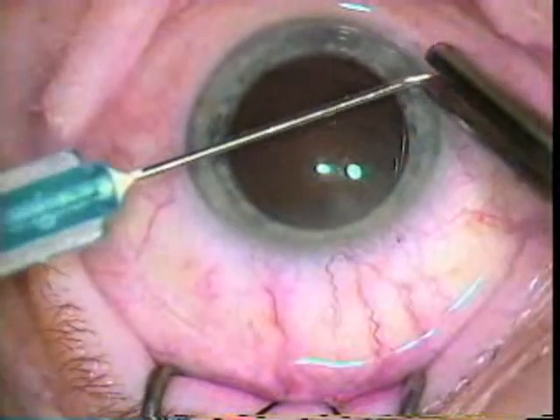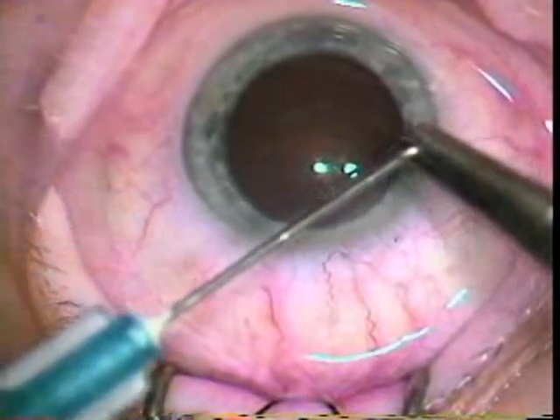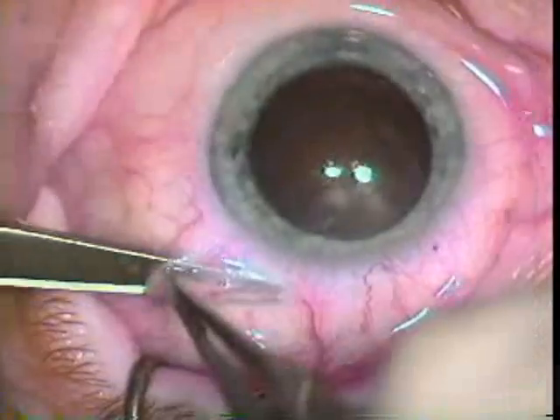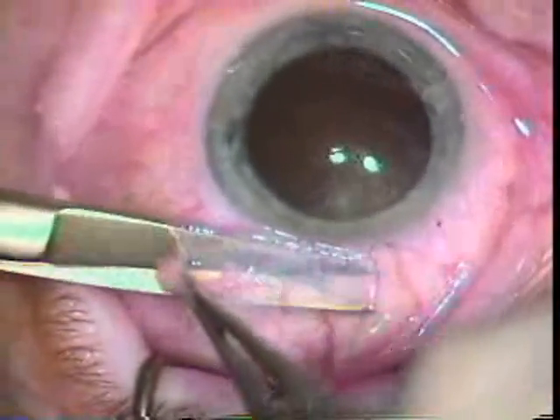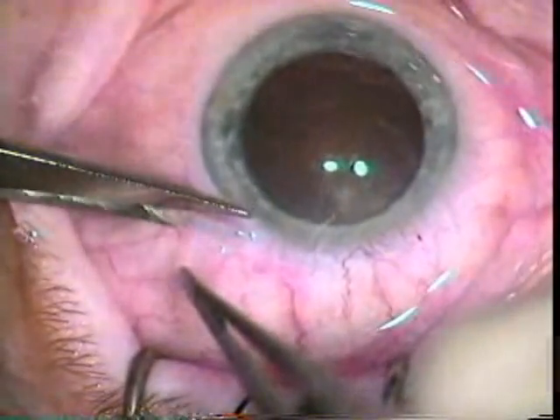At this point we would bend our own cystotomes. This is a 27 gauge needle and Dr. Kolder is bending it himself to allow him to do the capsulotomy.